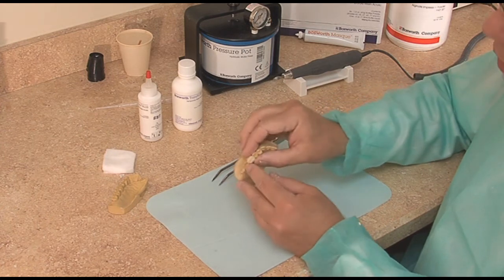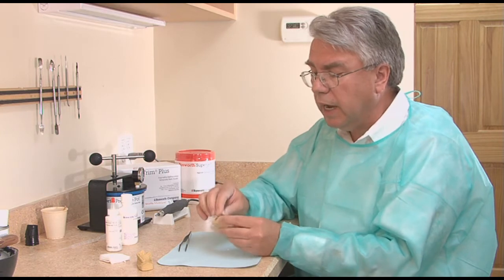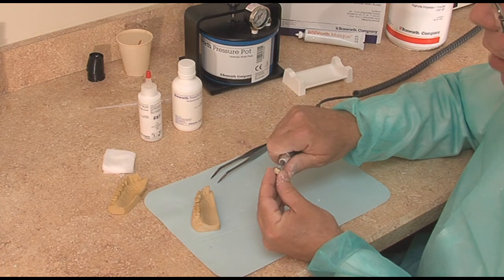The occlusion is going to be sitting high a little bit, as you can see. So I know it's going to be sitting high, so before I even try it I may trim a little bit of the occlusion down.